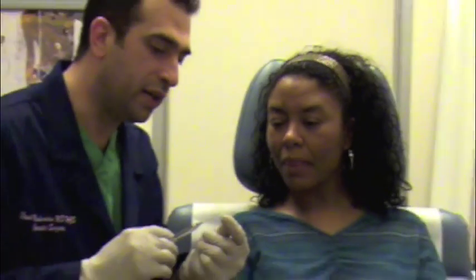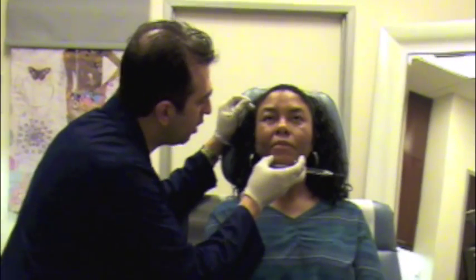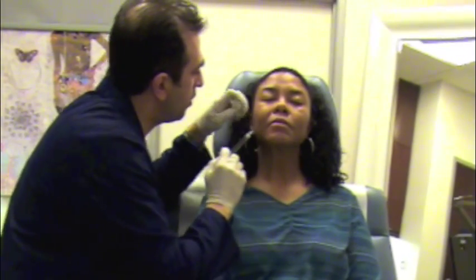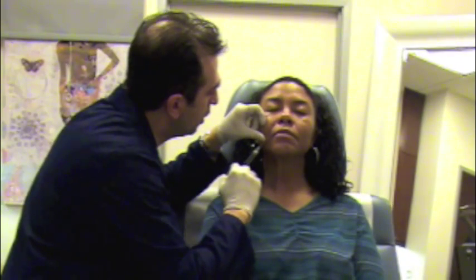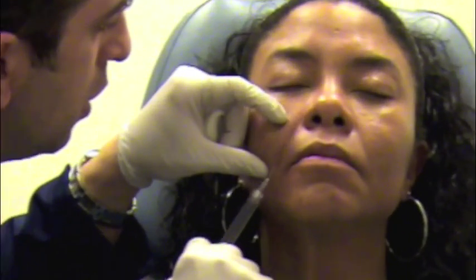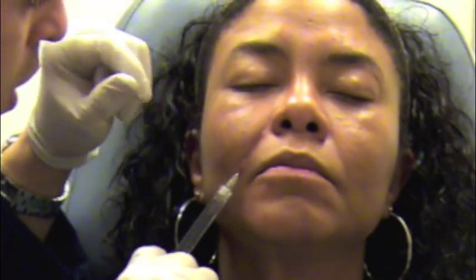This is actually not a needle. This is a blunt tip. So we made 1 little small skin piercing, and we're going to find that. If you can bring your chin a little bit higher up for me. Thank you so much. All right. You may feel some discomfort as I'm entering the skin. It's going to feel a little bit funny. Are you okay there? Mm-hmm. Does that hurt you, sweetie? Mm-mm, not at all.